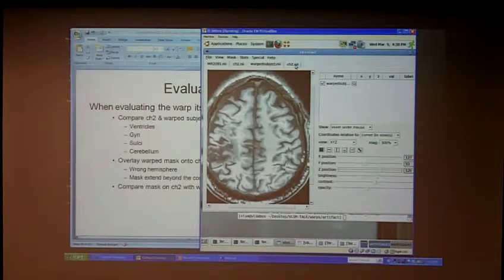We had reliability way back when we first started this. But as we were talking about before, the approach to tracing lesions has really changed, so who knows about the reliability of this now? There are a couple of things that we did in the old script that I know. One is we did increase the size of the lesion just for masking. We never used that increased masking.